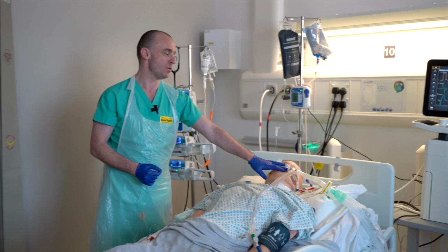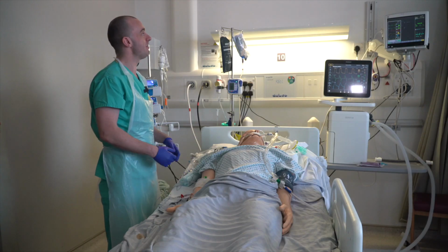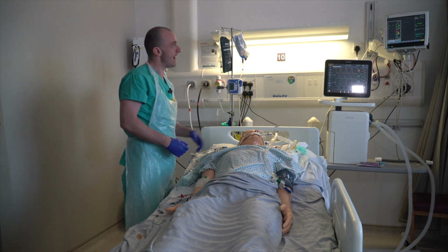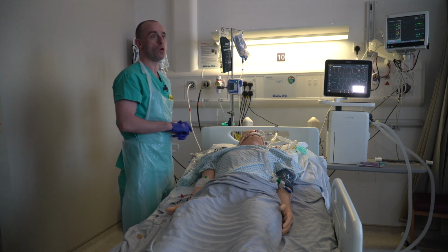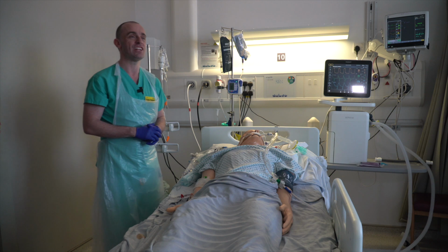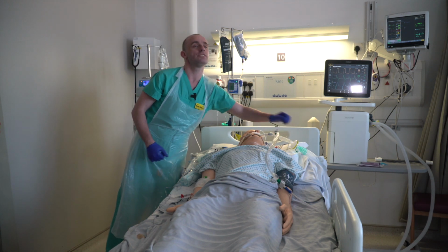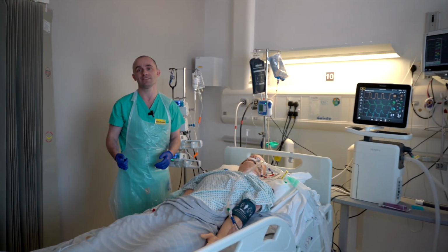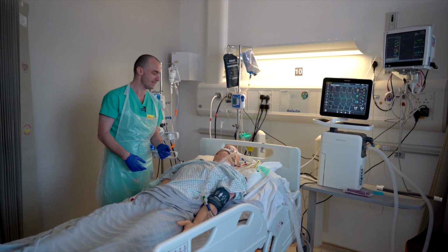Also, when I look at the tube, can I see misting? That would imply it's within the trachea. And if I look at the screen, which again, there's a separate session on monitoring, at the bottom we'll see that there is a number, which currently reads around 4. That is the end tidal CO2. That essentially is a measurement coming from here of gas exhaled, and that only comes from your lungs, not from your stomach. You don't get CO2 from your stomach. Therefore, we can be reassured that the tube is in the right place.